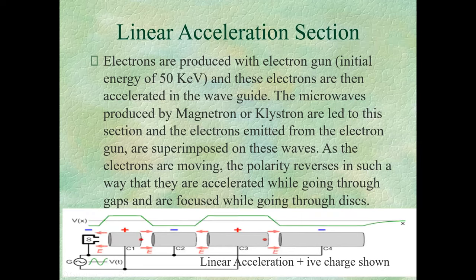So if you are thinking in that sense, it's this part of our machine, the flattening filter, which is increasing the energy of a regular beam, and then the energy of an FFF beam decreases because the beam does not get hardened. It doesn't have any flattening filter to pass through. And we will also discuss FFF in the coming slides, in a little more detail. So in case of the electrons, here you can see we have some scattering foils. So we get scattering foils for electrons and flattening filters for X-ray beams. And again, we are in this section of our journey.